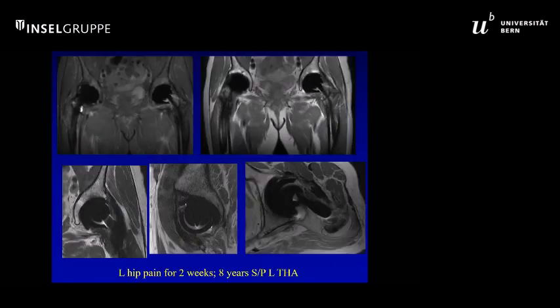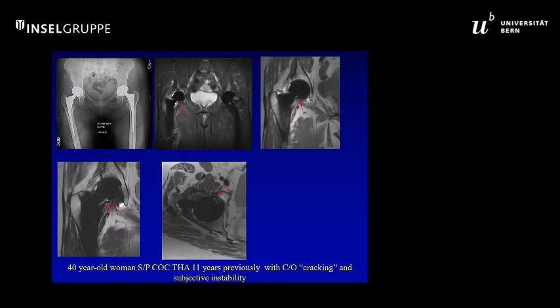This is just a fun case. Look side to side. If you look at the upper 2, just compare side to side. You could say this is an ultimate dual mobility. It's displaced all the way into the iliopsoas recess. You can see the liner is all displaced. X-rays are, of course, negative in this setting. Patient with left hip pain.